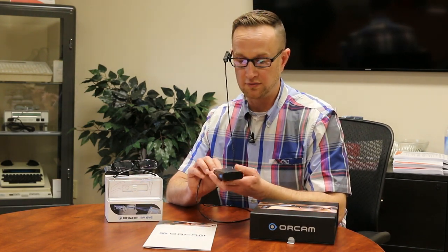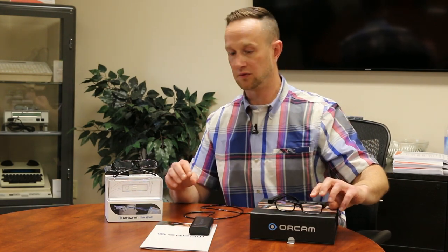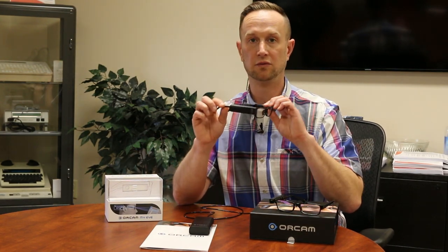This is the MyEye 1.5, which is the most common one — it has all the functionality and is wired. There is now a wireless version: the MyEye 2.0. If you want all the features of the OrCam in a wireless device, the MyEye 2.0 would be the one for you.